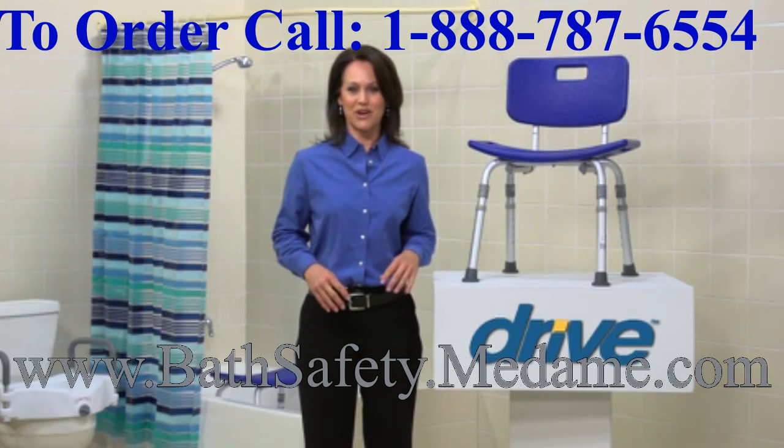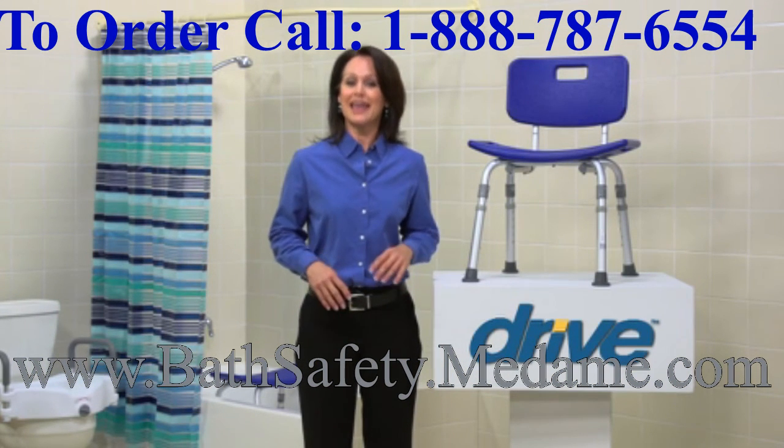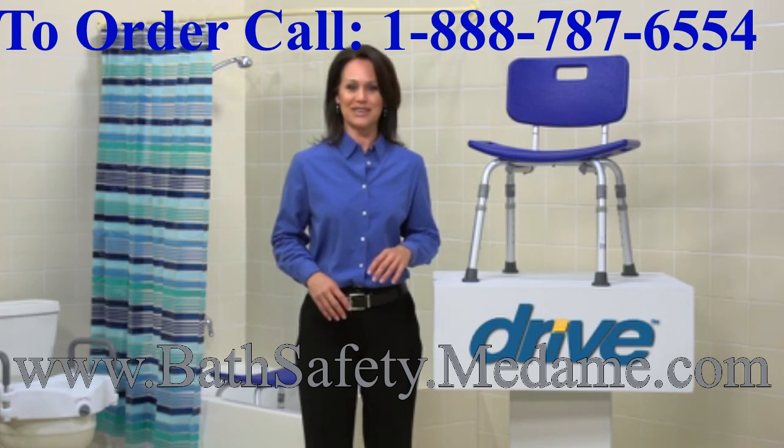You can always count on Drive Medical to bring you convenient and innovative lifestyle solutions, now and for the road ahead.